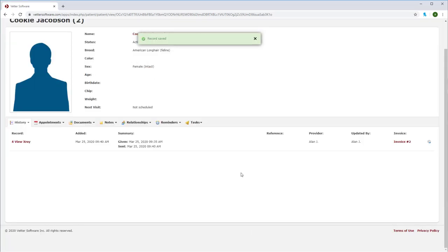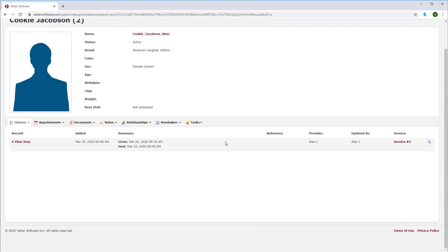Now that the request has been sent to the x-ray work list, go to the x-ray acquisition PC, select and query the work list. You should see the patient name populate and you'll be able to create a study now. Go ahead and capture images and then end the study.